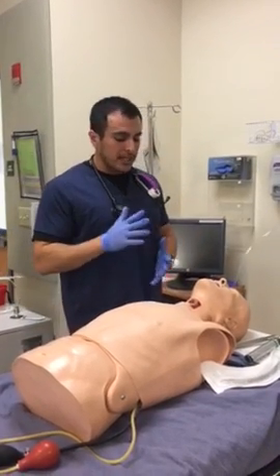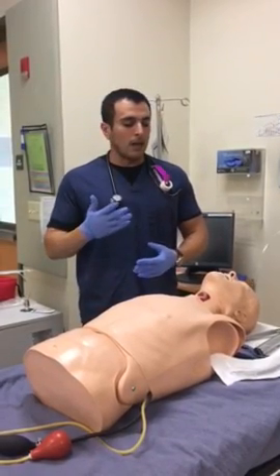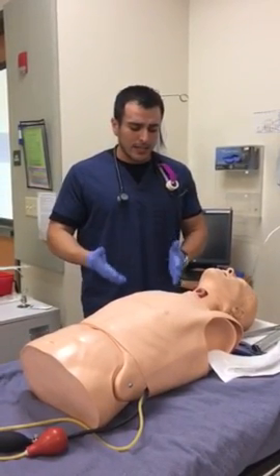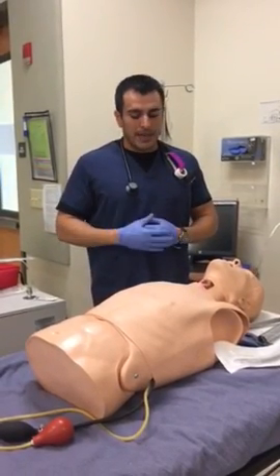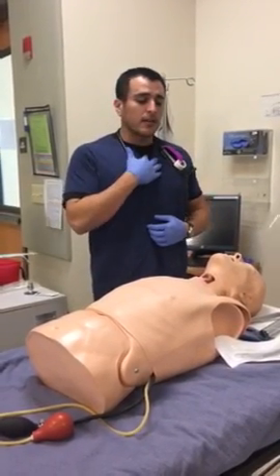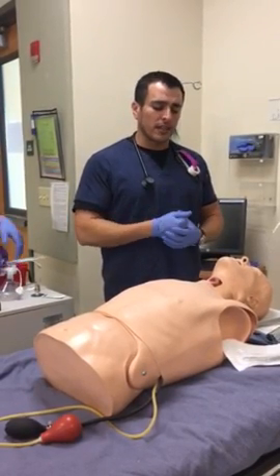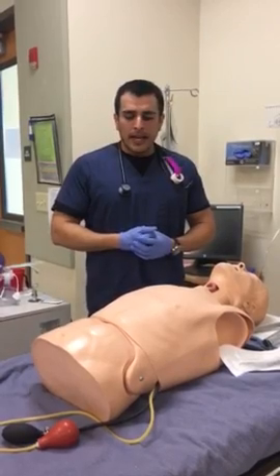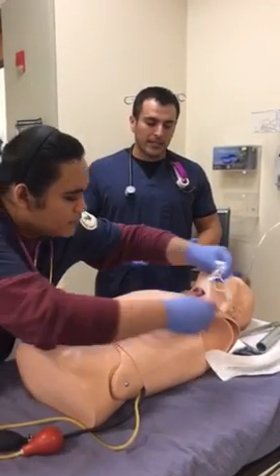There also could be too high of tidal volumes on the ventilator, so there could be possible barotrauma, volutrauma. What that is, we could over distend your lungs, and there could be some damage caused by that. There could be some irritation in your throat, so there could be some edema or anything like that if the cuff is overinflated.